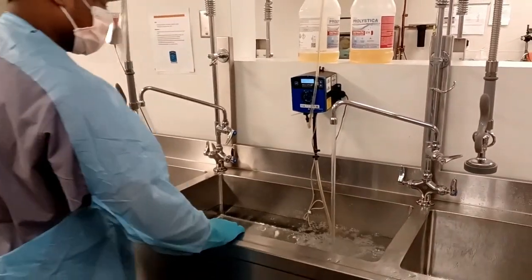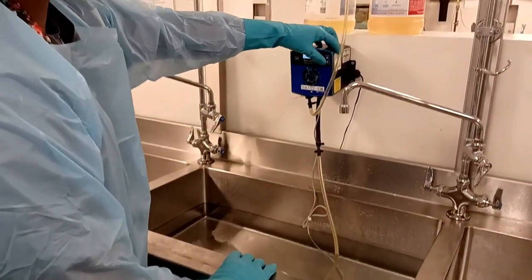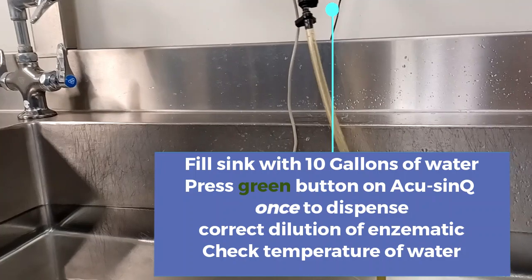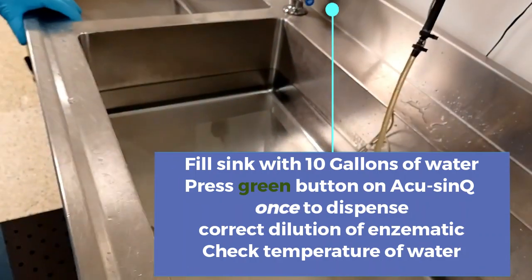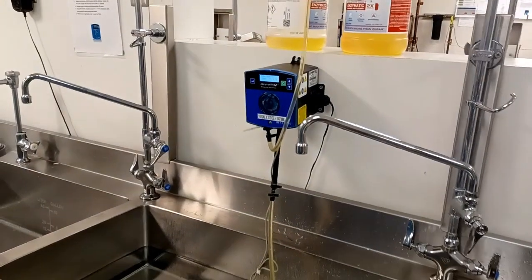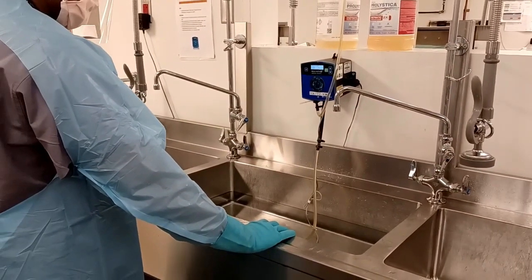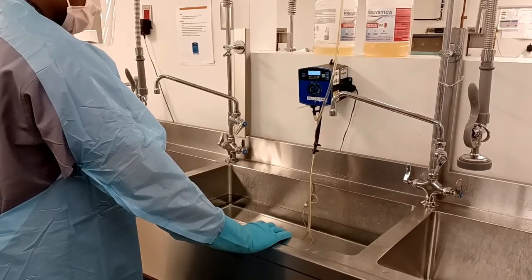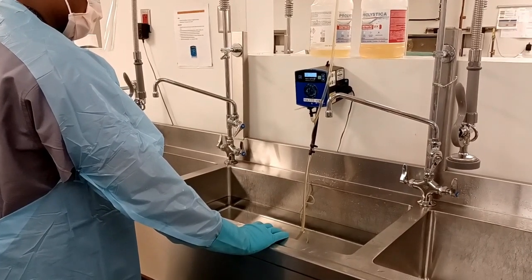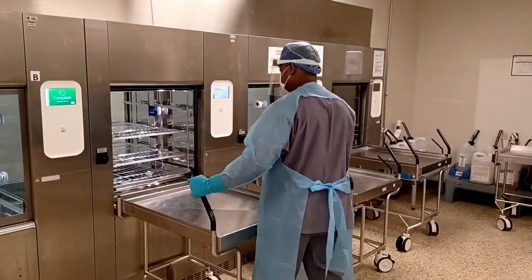Once your sink has reached its 10-gallon level, turn the water off. Push the green button on the AccuSync one time to dispense the correct dilution of enzymatic. Your sink should be clear with the enzymatic inside of it — this allows you to prevent injury by being able to see everything in your sink all the way to the bottom. At any time when your sink is grossly soiled or the temperature of water has reduced below 99 degrees, repeat the steps of refilling your sink to 10 gallons and adding more enzymatic.